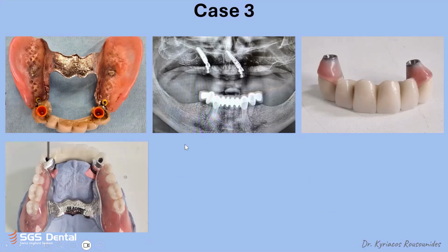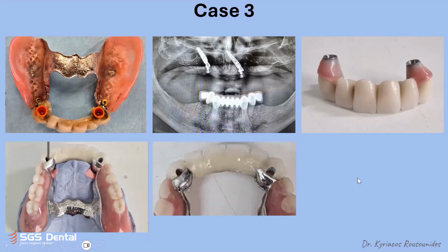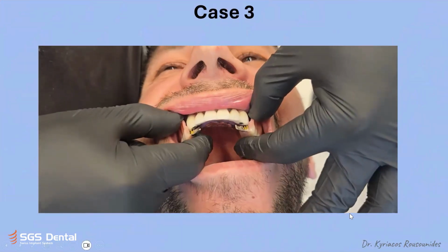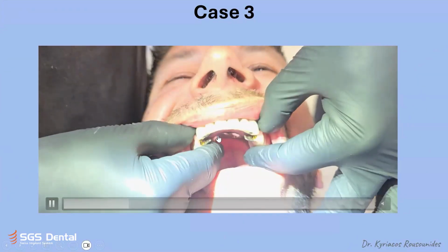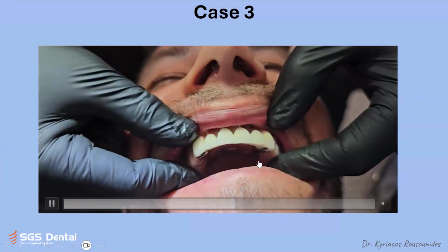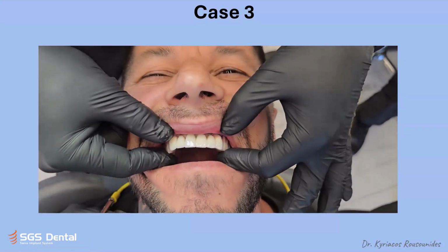This was done only because we had to work with the right abutments. The multi-units gave us the opportunity to come direct in the position that we wanted. And you can see here, after we screwed the 6-unit bridge, how his prosthetic works.